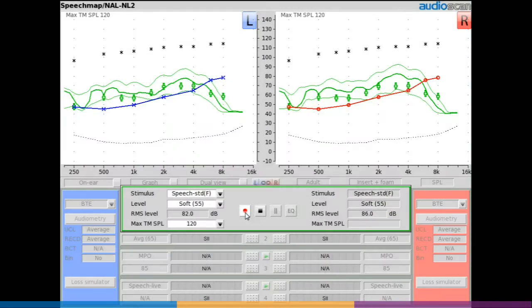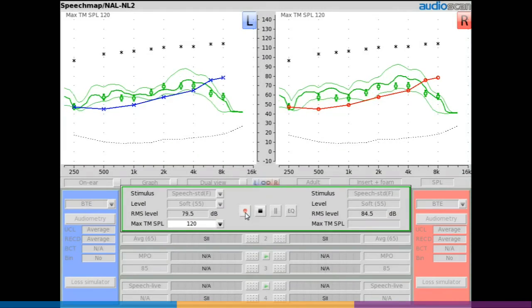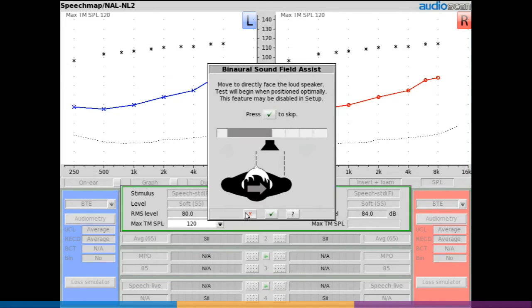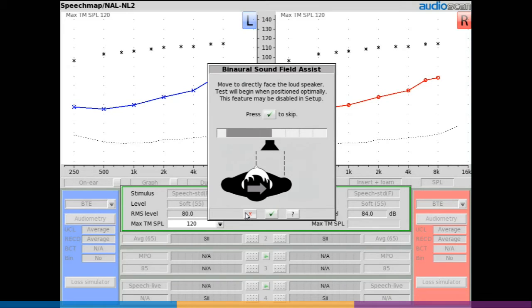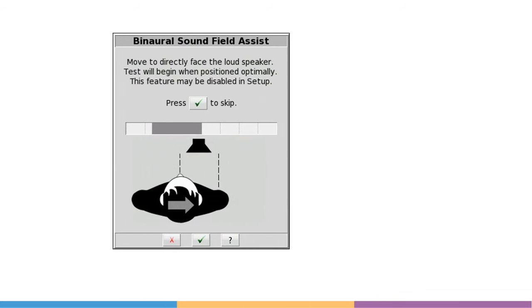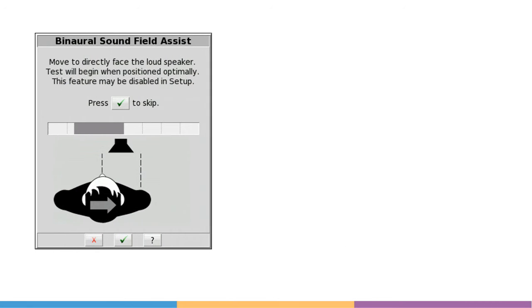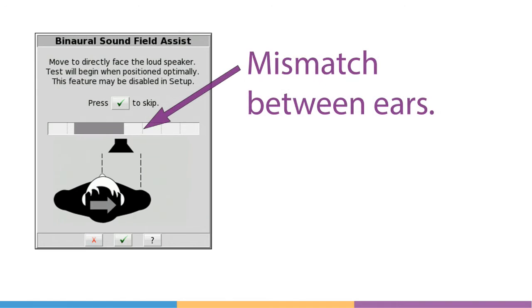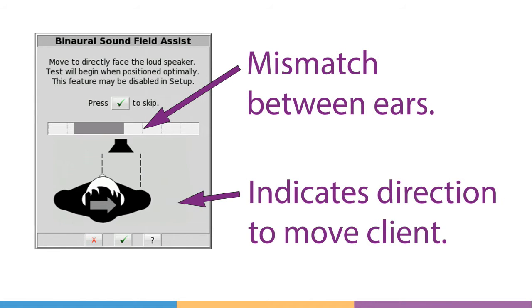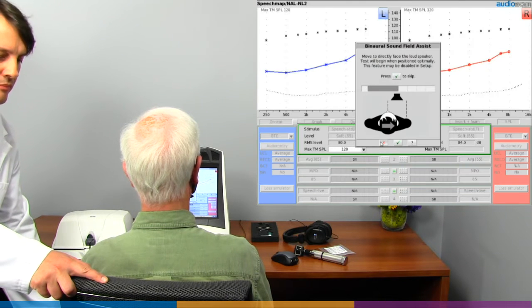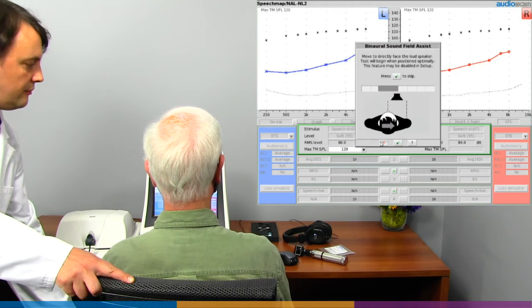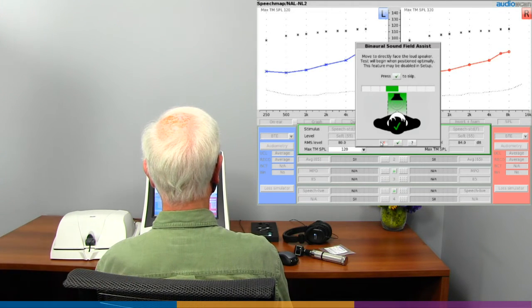If a sound field imbalance of the magnitude previously described is detected across ears, the binaural sound field assist tool will be presented on screen and a broadband equalization sound will be emitted from the test speakers. The bar graph shown on screen by the tool will indicate the amplitude of the mismatch across ears, and a patient positioning arrow will point the direction to move the patient. Generally, this will be a small adjustment and always in the lateral direction, left or right.